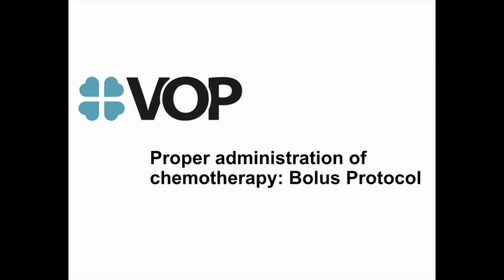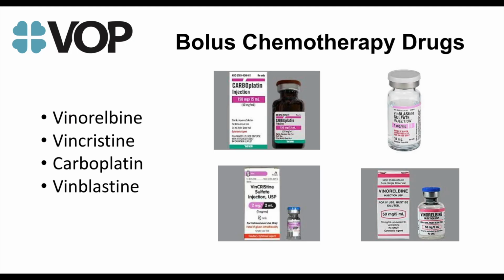In this video, we will walk through the proper way to safely administer an IV bolus of a chemotherapy drug. Examples of chemotherapy drugs that are given as an IV bolus are listed here.